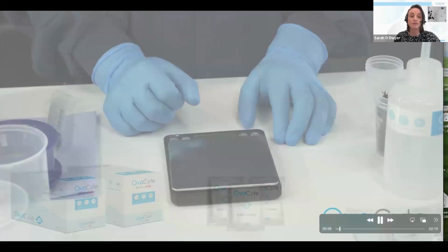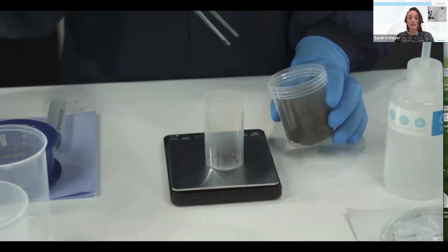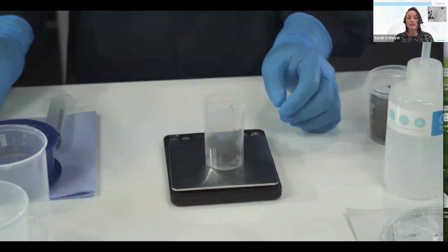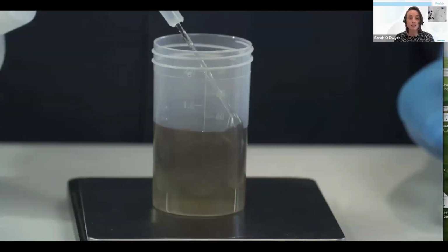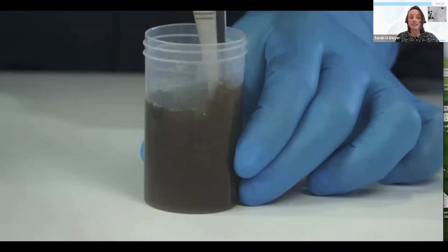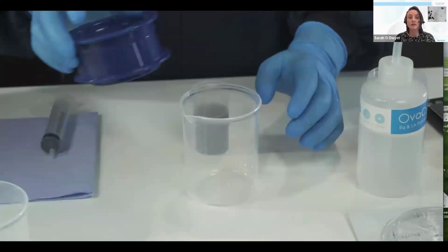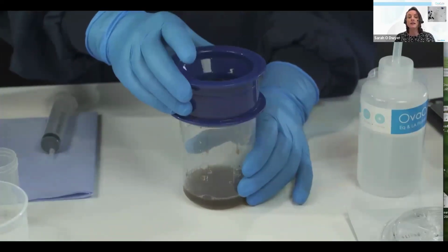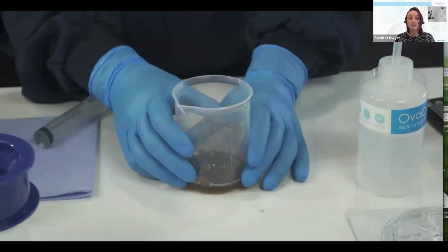I'm sure you're all very familiar, but just to recap, you're weighing out your 3 grams of feces, as near as you can get to a representative sample, as we know from many areas within the pat of feces. You're adding your flotation fluid up to 50 grams, and then giving it a really good mix to get those eggs out from congregating together into the suspension to give you a representative sample. Then you're filtering. Make sure you're cleaning the filter with soapy water afterwards and letting it dry out completely, and giving it a good tap to get those eggs through.